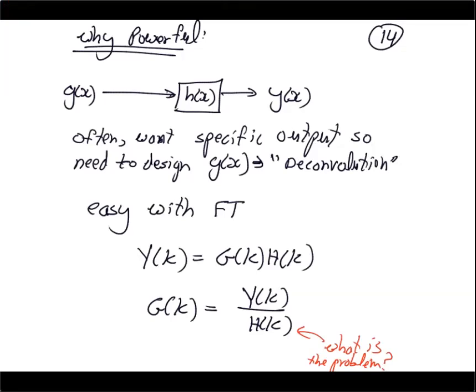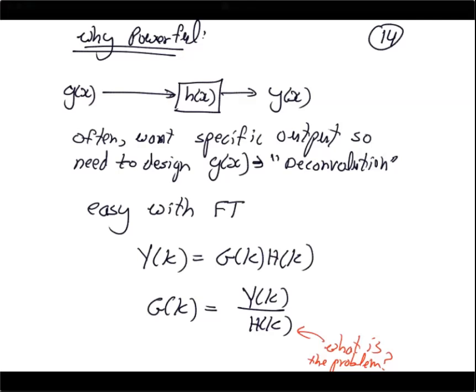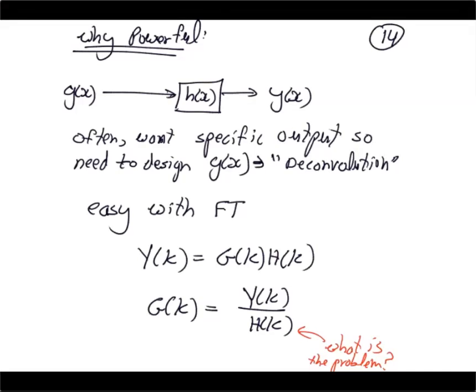So you have to realize, if somebody says, oh, just deconvolve the signal, well, convolution can always be done, but deconvolution cannot always be done. Convolution is a lossy operation. If h of k has some zeros in it, then you lose that signal and it's just not possible to reproduce it unless you know some other things.